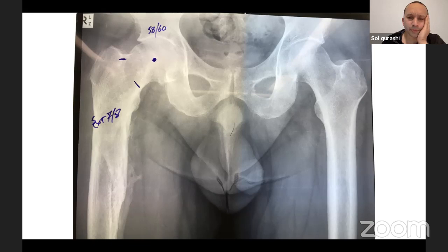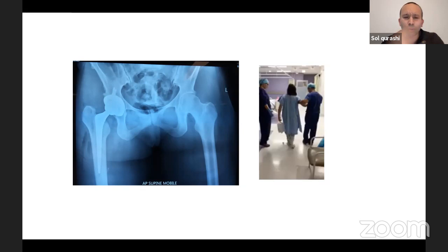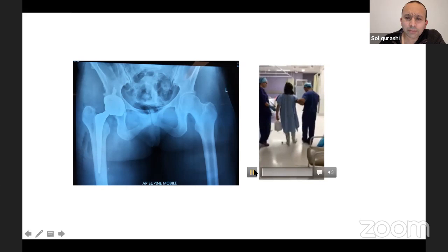This lady, the canal was very small, you know, the size one stem did not go down. It would have lengthened her like a couple of centimeters. So I cemented in an Exeter. This is her in recovery a couple of hours afterwards.